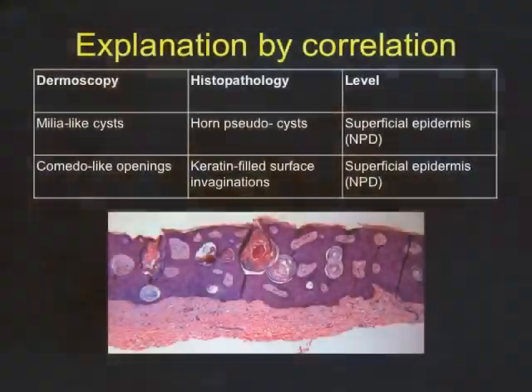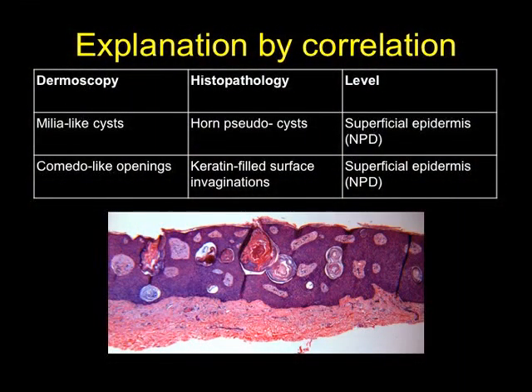So again, that's showing you that you can really only see the milia cyst with standard dermoscopy. With polarized light, you can't, and that is indeed a seborrheic keratosis. The explanation for that is your milia cysts are sitting up high in the skin. Polarized light doesn't penetrate, doesn't change its angle of polarization at that depth, and therefore it's blind to these structures. You won't see them.